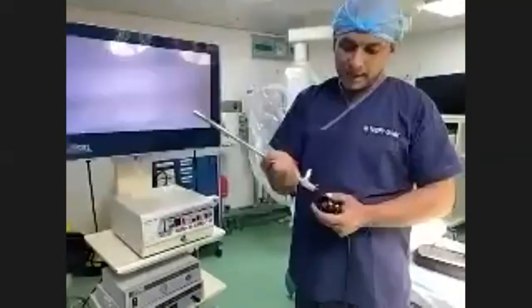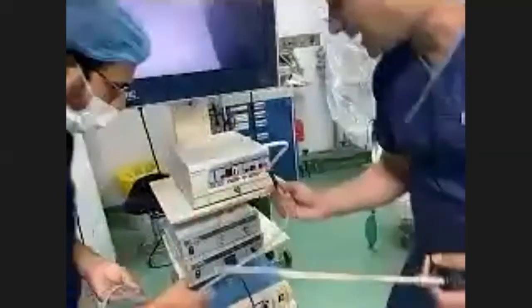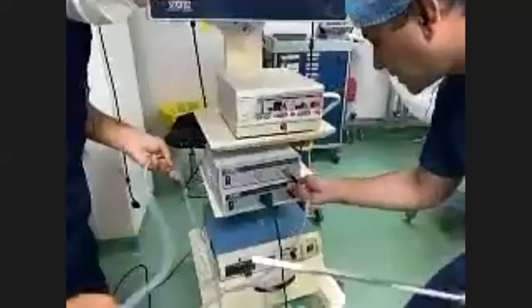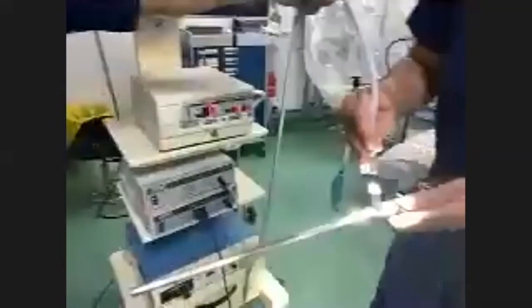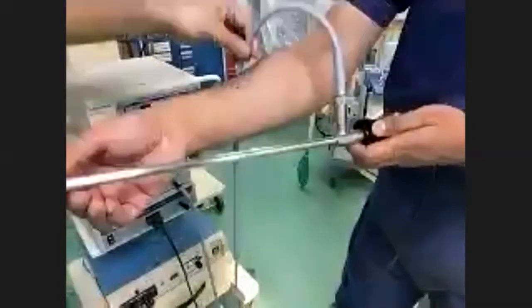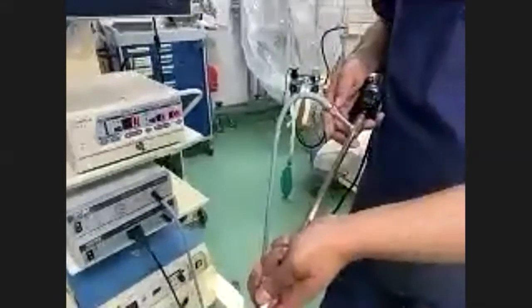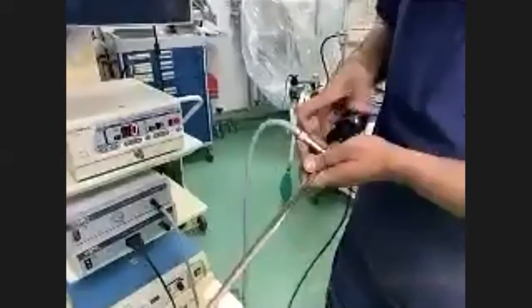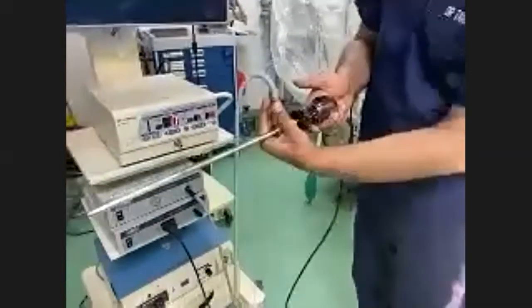Here we attach the telescope, and we attach the light source exactly over here. And we attach the other end of the light source with a knob over here. Here you can see the shaft of the telescope. Here is the place to attach the telescope, the camera, and the light source. And here the telescope is attached with this knob. In this telescope, there are different components.